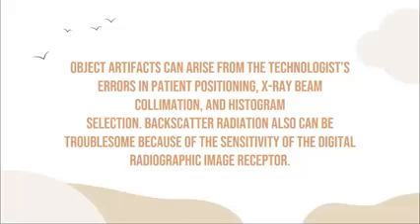Okay? As previously discussed. Backscatter radiation also can be troublesome because of the sensitivity of the digital radiographic image receptor. So, what is backscatter radiation? If a lot of scattering material is present behind the image receptor, okay, for example, na ay positioning dial sa likod sa image receptor. Okay, so we all know that the main scattering object or the main scattering subject is the patient man. So when that happens, if the radiographic positioning dial has the same tissue density as the normal human person, they can also produce a scatter radiation. Okay, backscatter radiation can cause a phantom image.